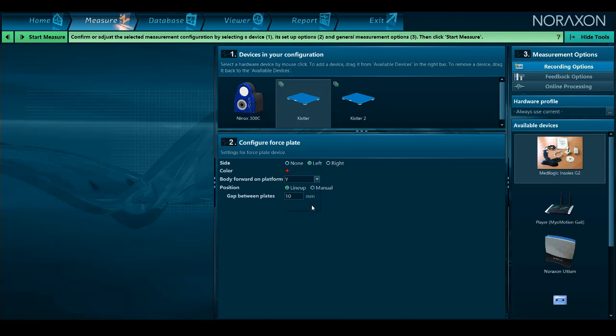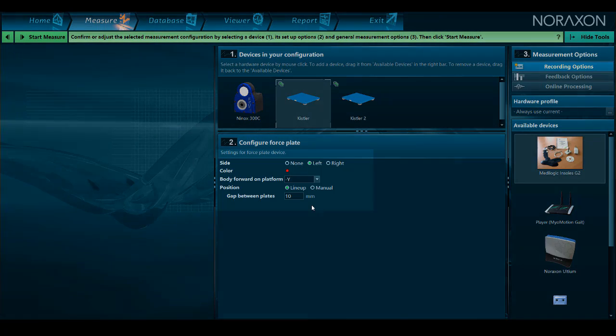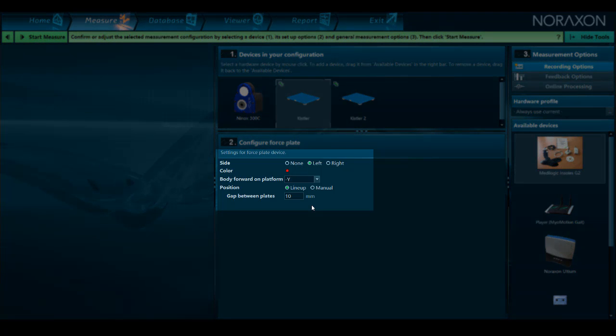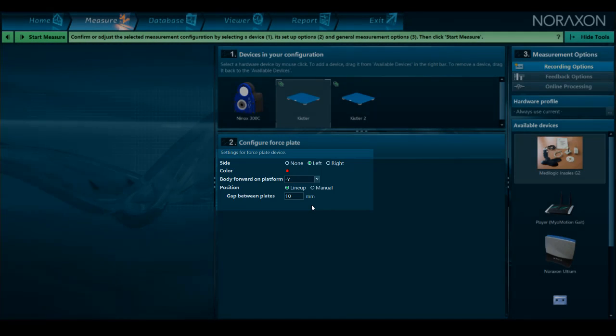The x-axis is the short axis and the y-axis is the long axis. You can also change the way the force plates are oriented next to each other and how far apart they are.